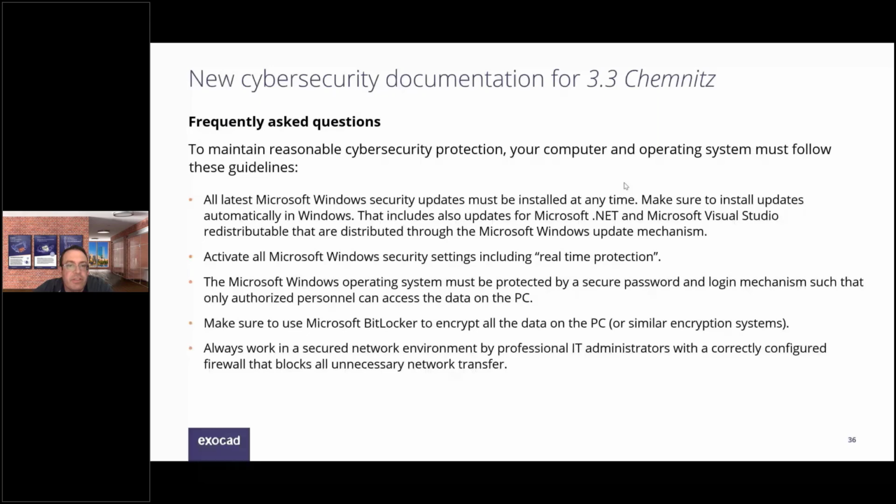Again, just some more information about the cybersecurity. Make sure all the Windows security updates are installed for your drivers and operating system environment. Latest framework of the software is installed. Microsoft Windows operating system must be protected by a password to prevent unauthorized personnel from accessing the data on the PC.